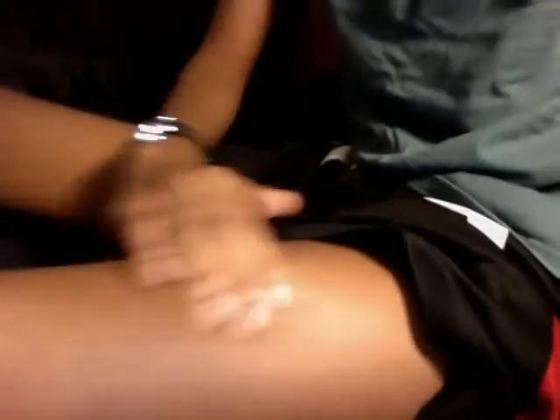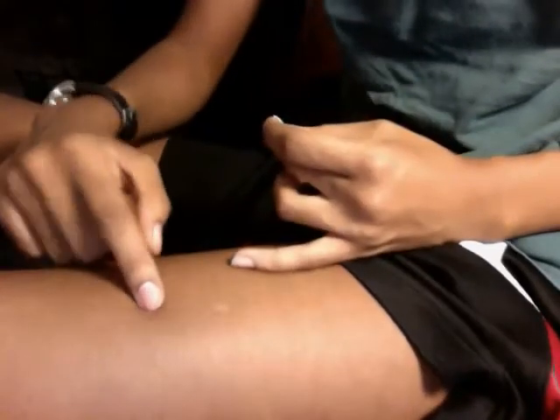Now it's time to prep my leg. This week I'll be injecting in my right leg. I use a separate alcohol wipe to clean it, since by the time I'm done prepping, the first one has already dried. The area I'm injecting is on the outside of the thigh bone. I clean in a circular motion from the inside out, which keeps you from dragging germs from other parts of your leg back into the injection site.